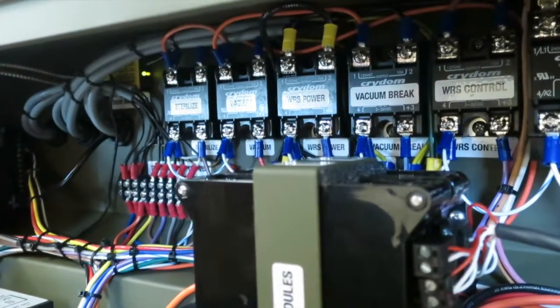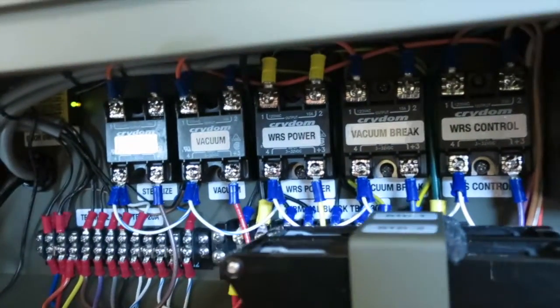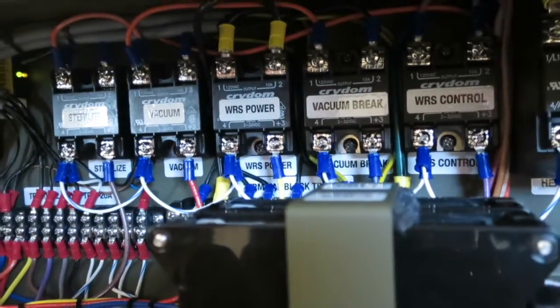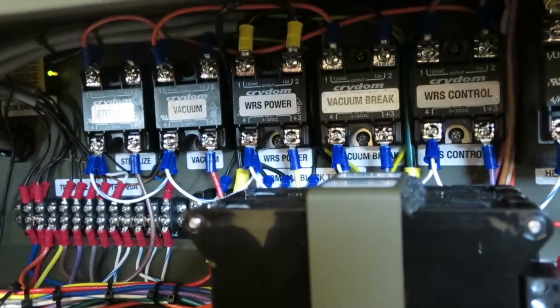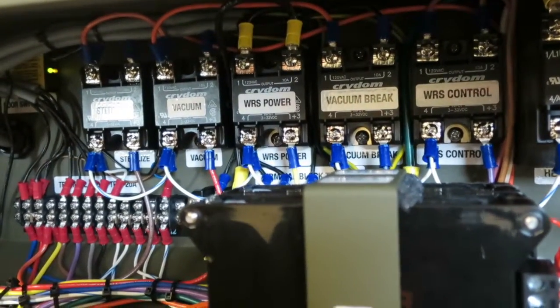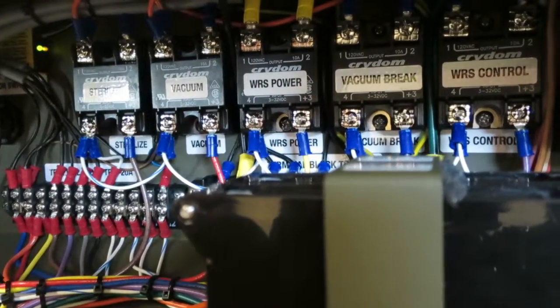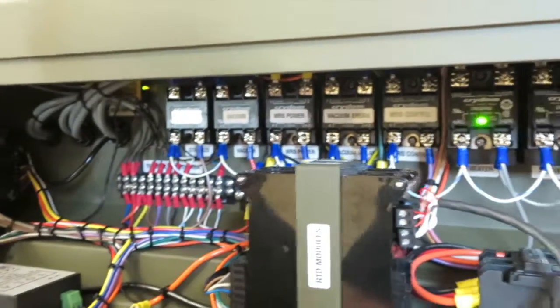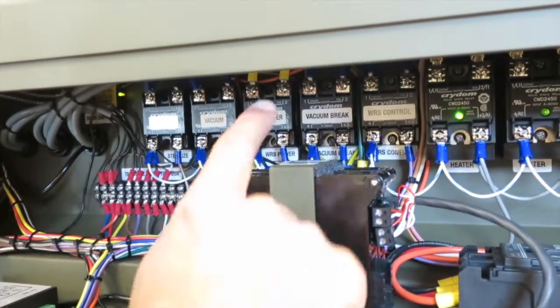This is a little unique. Remember I mentioned that the sterilizer main unit supplies power to the water recovery system. That water recovery system power, it's always sending power down there. So when this unit is on, that's actually live, so that when you press the toggle switch to send water up to the sterilizer main unit, you can go ahead and operate the pump and pump water up to the sterilizer main unit.